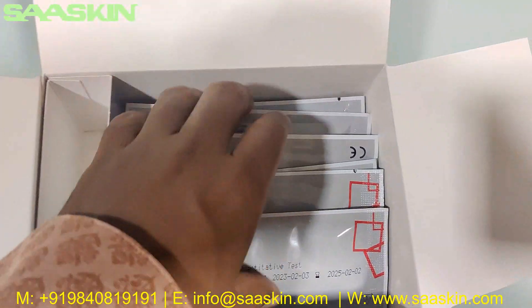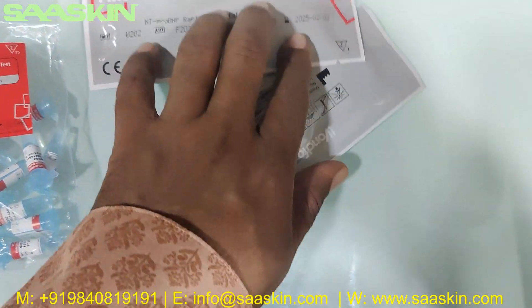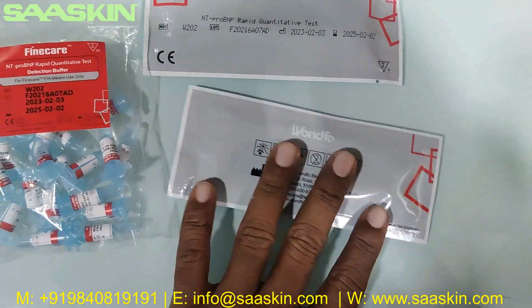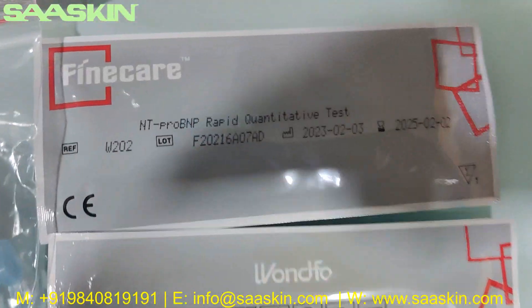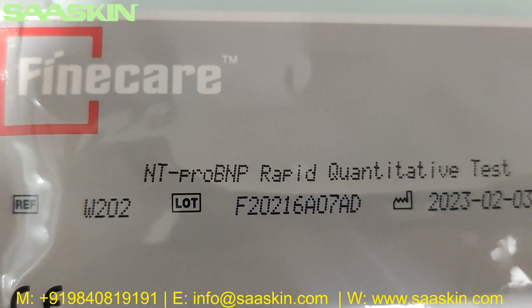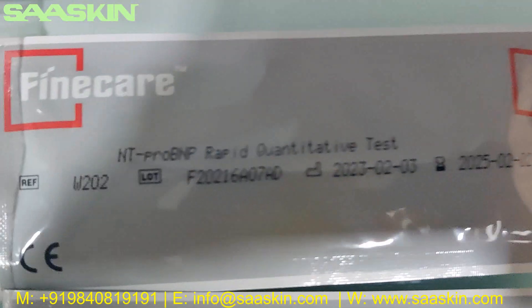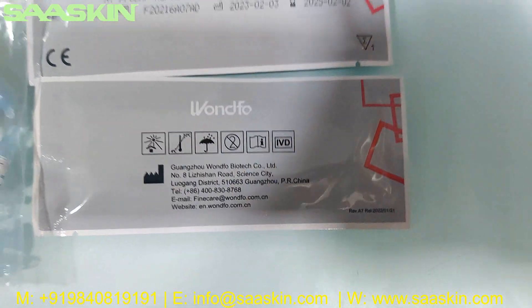Inside you can see the 25 test cartridges. I'm going to pull two out. Fine Care NT Pro BNP Rapid Quantitative Test — the reference number, lot number, manufacturing and expiry date.